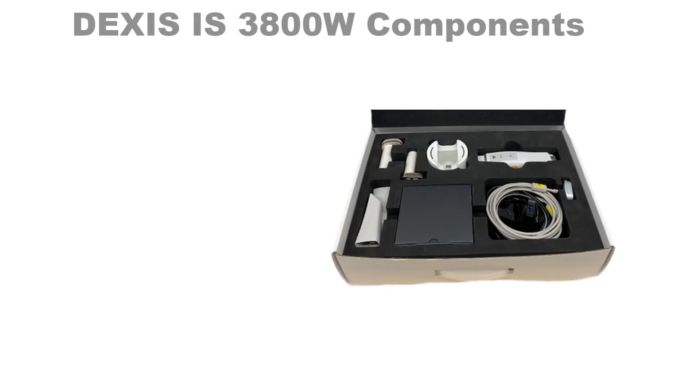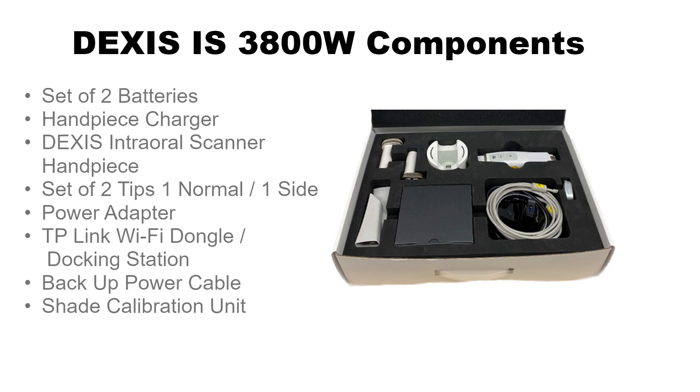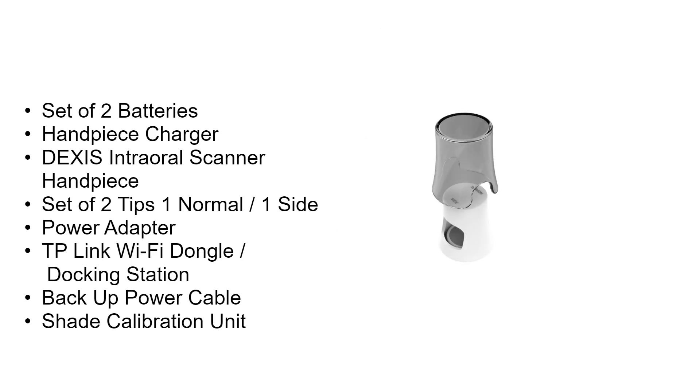The DEXUS IS3800W is delivered with the following components: a set of two batteries, a handpiece charger, the scanner handpiece, a set of two tips — one normal and one side — a power adapter, a TP-Link Wi-Fi dongle and docking station, a backup power cable, and the shade calibration unit.